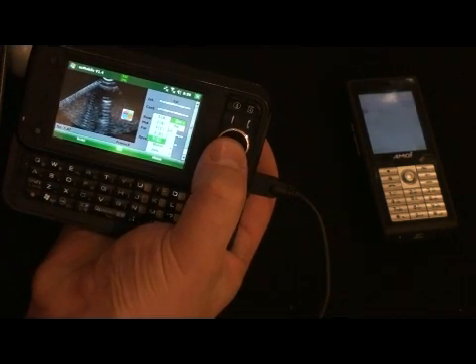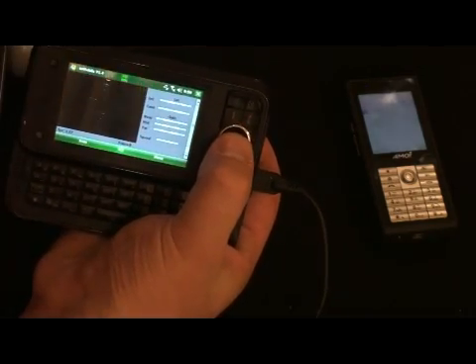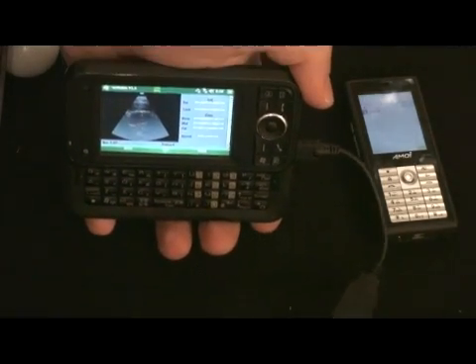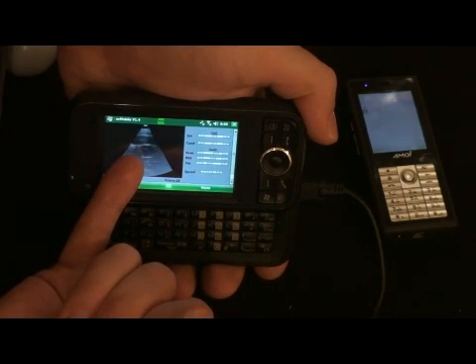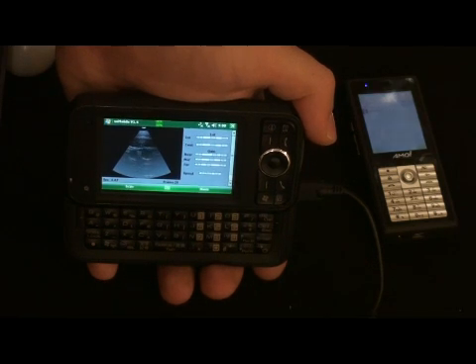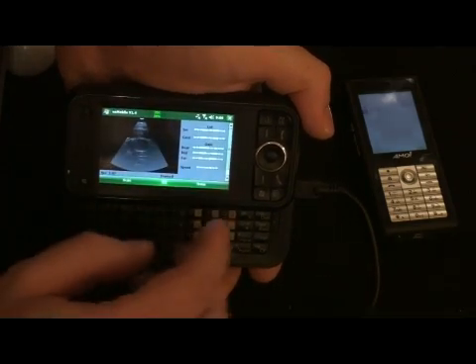I'm going to load a file that's been previously saved. This image right in here — I am looking at my previously recorded carotid artery. You can see the bifurcation as I move up the neck, and as I move back down, you can see the artery as it becomes one again at the connection point. So we have the ability to save and display after-the-fact images. We have full gain control and line image control with this system.